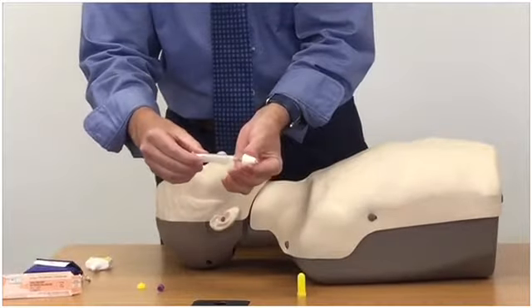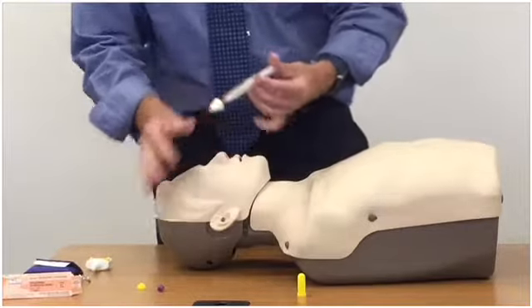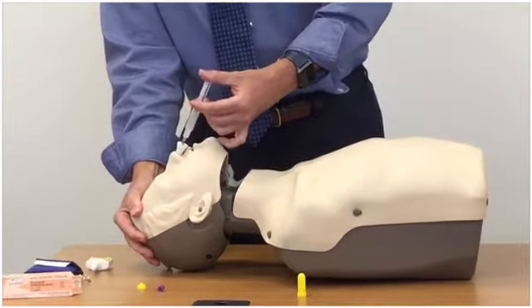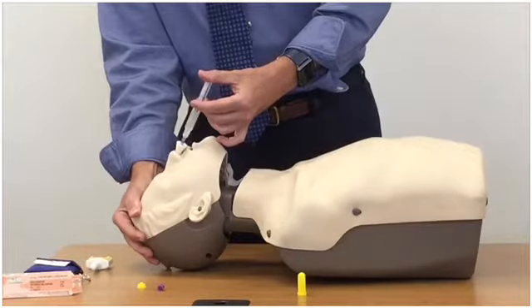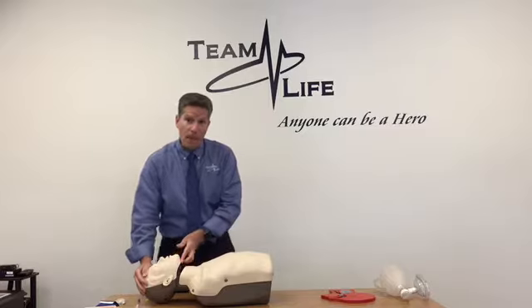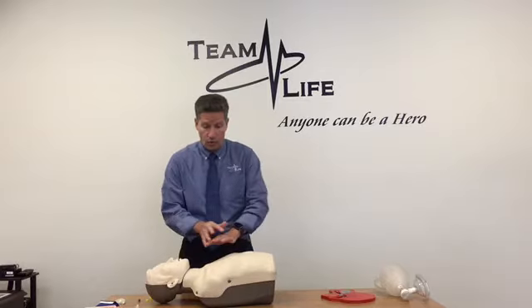At that point, I'm going to take the nasal atomizer, connect it, and just like we did with the other one, I'm going to open the airway, place into the patient's nose. I'm going to squirt the whole dose in, keep the airway open, and observe for breathing. If the patient doesn't begin to respond quickly, within about 30 to 60 seconds, I need to go ahead and start CPR.